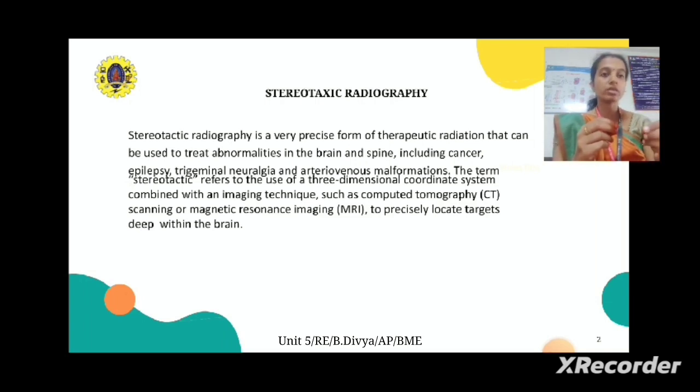It can treat abnormalities including cancer, epilepsy, trigeminal neuralgia and arteriovenous malformation.